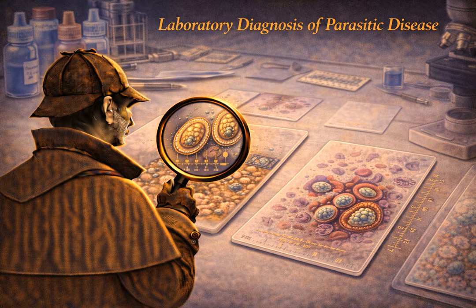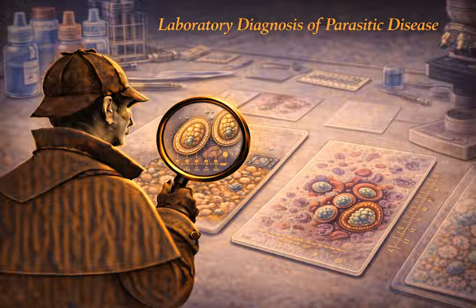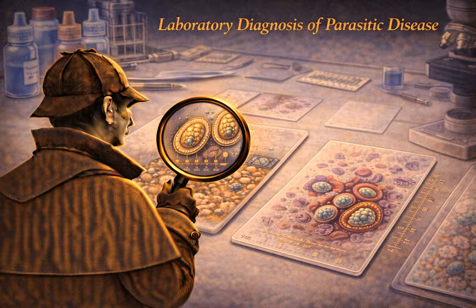sitting on the bottom. But because all the red blood cells have been exploded, you have lost all of your vital context. You can't see the size of the red cell. You can't see the shape. The delicate parasites themselves are often warped and look like little distorted pieces of purple shrapnel. So you can confidently say, yes, this patient has malaria, but you often cannot tell which specific species of Plasmodium it is. And that is exactly where the thin film comes in.